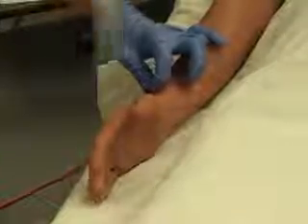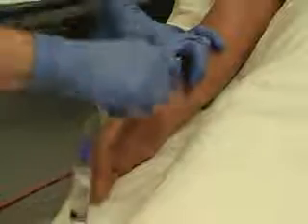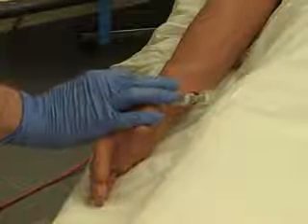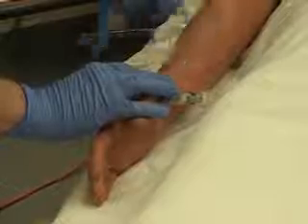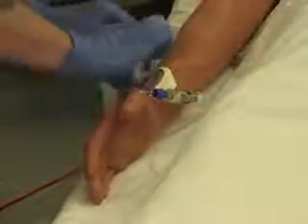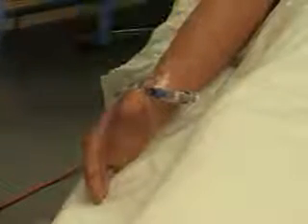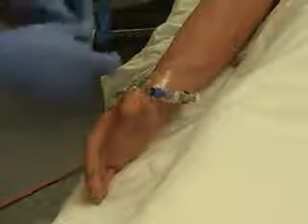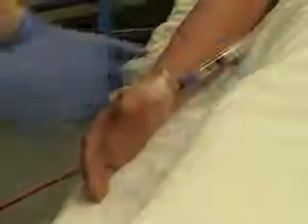Make sure your non-dominant hand keeps the site secure. Attach the luer lock. And flush with the saline. Secure the site with the opsite and with tape. Your IV should look something like this.